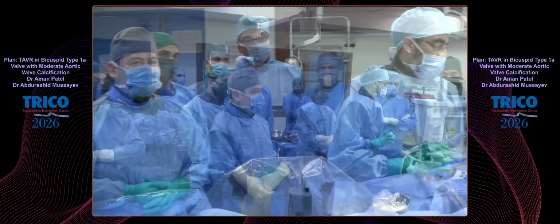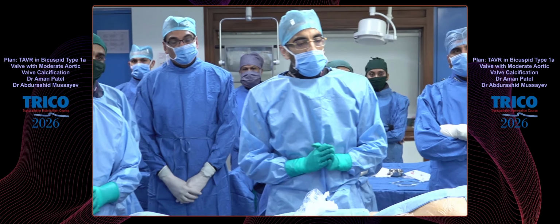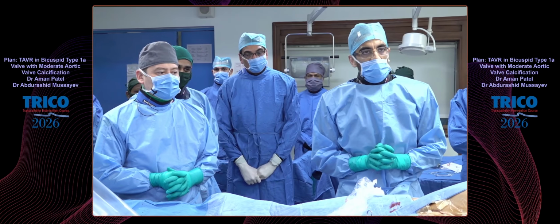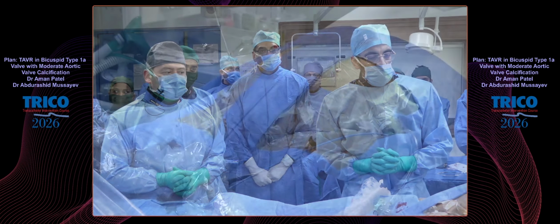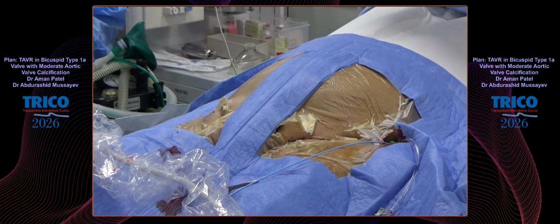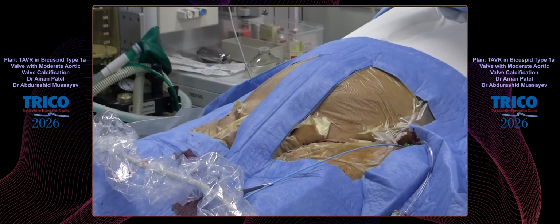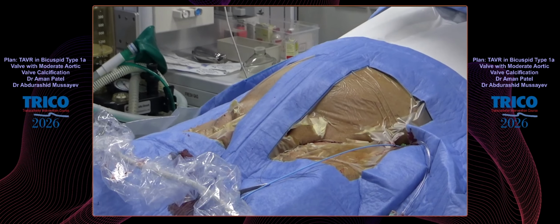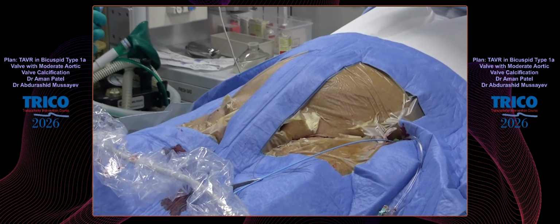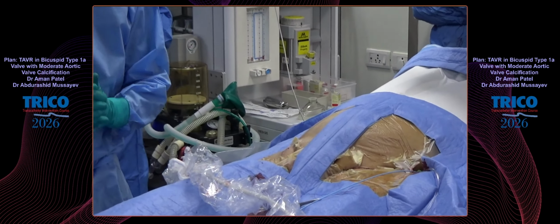The plan is to do a minimally invasive procedure. We just have two arterial accesses. One is the left radial access for pigtail placement, and we are going to take the major vascular access from the right femoral. Temporary pacemaker we are not planning to implant. We are going to do wire-based pacing with the Safari wire. The patient has two peripheral lines for infusion, and now let's go to the case.